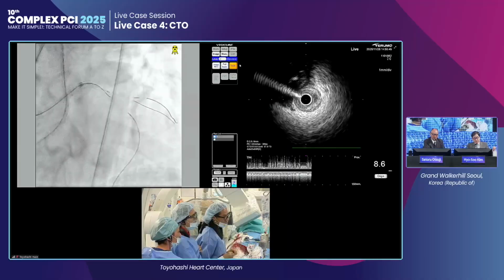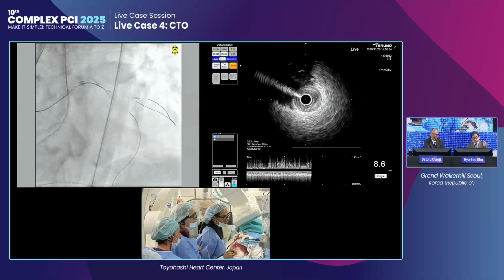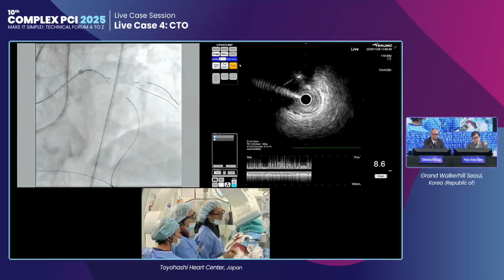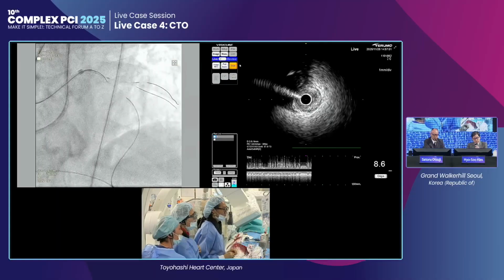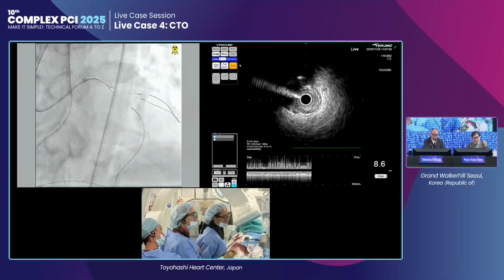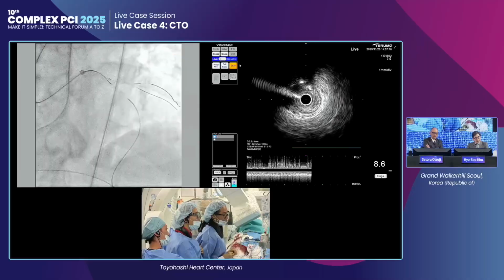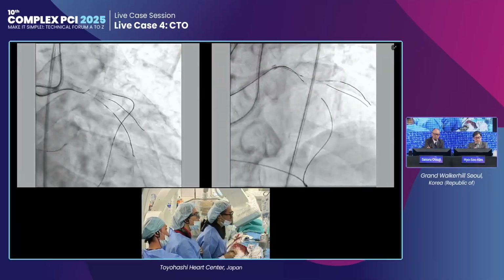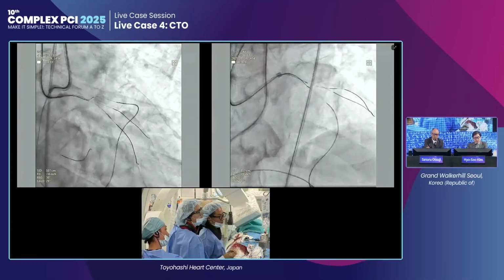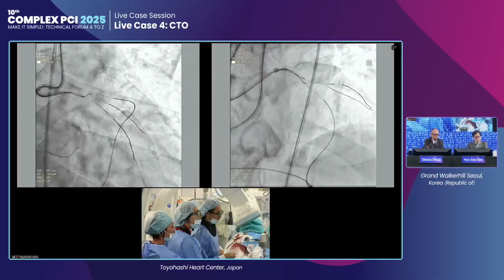He mentioned antegrade usage of a multi-channel catheter, because now the antegrade wire can access D2 easily. When you put the antegrade wire into D2 and leave it alone, you can use another antegrade wire under the Sasuke to negotiate antegrade penetration. But I think if you focus a little bit more, because the antegrade wire direction is good, you can find the true distal lumen, or wire escalation from the antegrade.